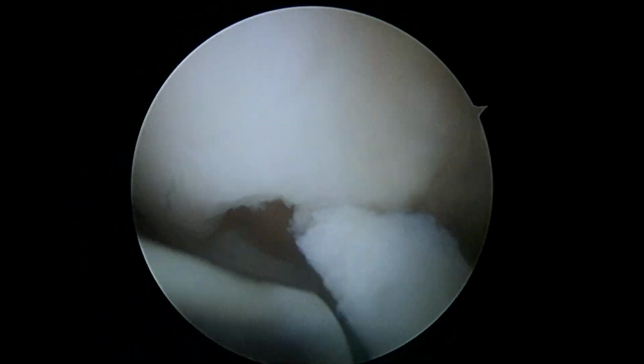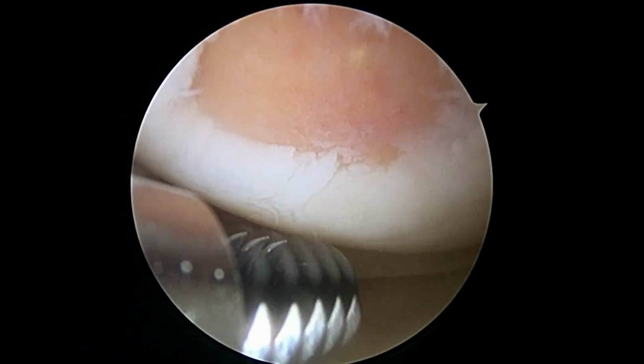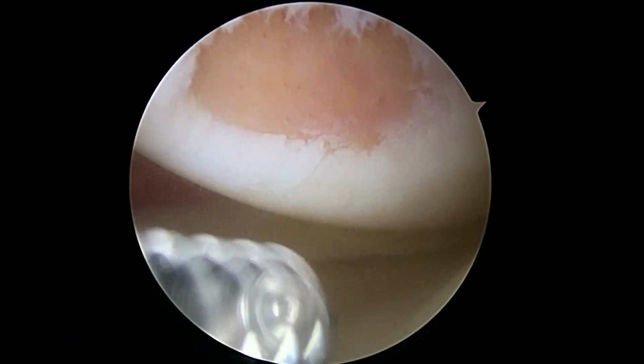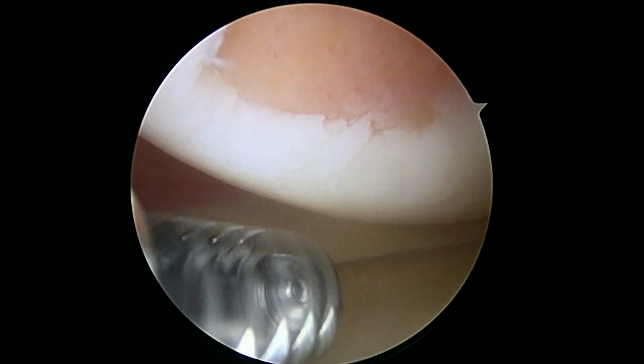Okay, so we're just getting started on the left knee. We've already harvested the hamstring tendons, and with our Biobrace, they're going to be a 9.5 graft. Or actually, I'm sorry, it's going to be a 10 graft. What we can see here is you've got this chondral defect that I'm not crazy about. I wish you didn't have it.